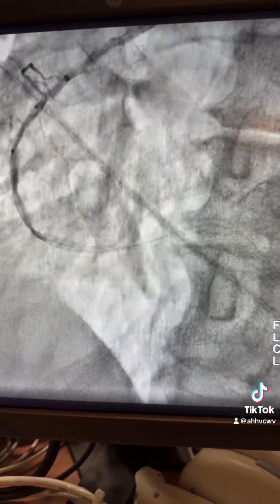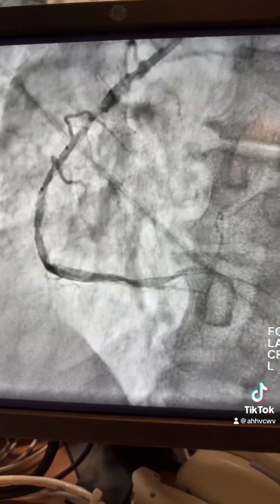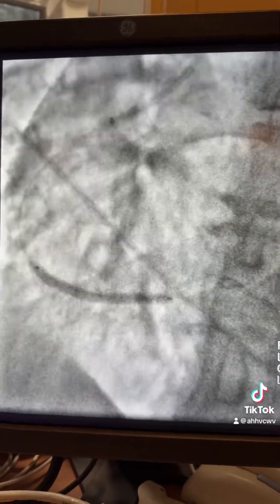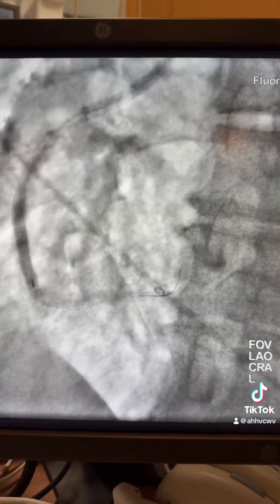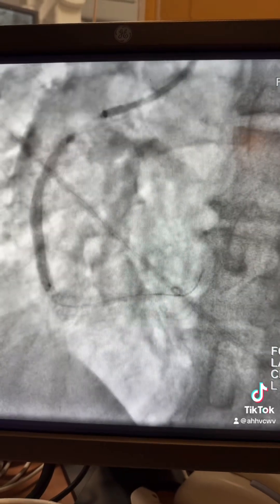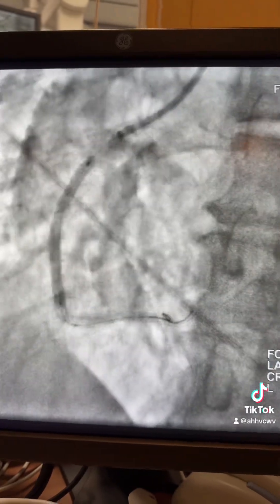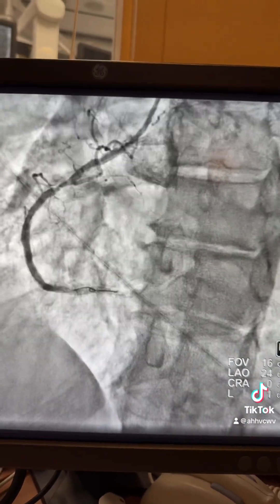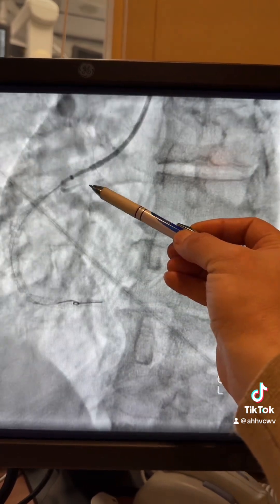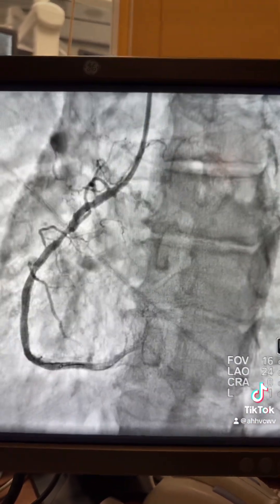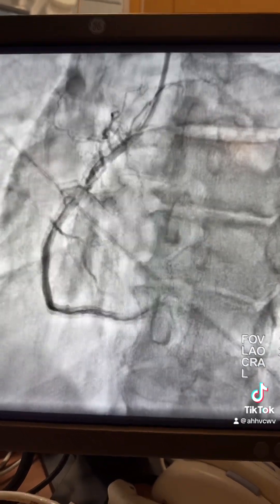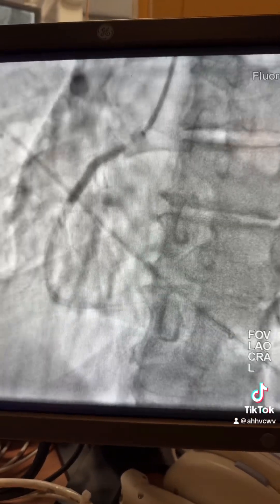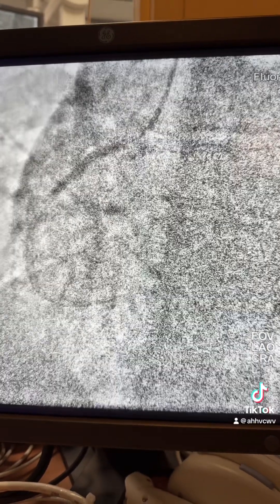Now you can tell where we're going to place the stent distally. Here is the distal RCA stent — a 3.0 x 38mm stent — followed by another 3.0 or 3.5 x 38mm stent in the mid segment. The angiogram shows we still need to cover the remaining area, so we use a 3.5 here and a 2.75 toward the PL, with the proximal stent overlapping the prior stent.